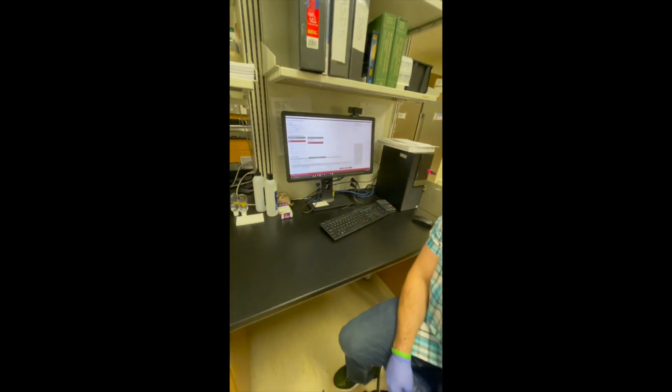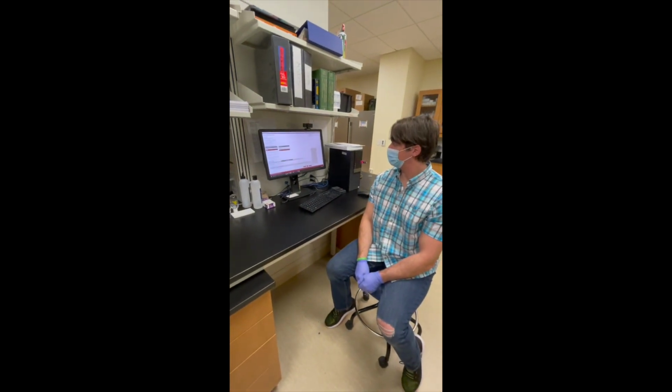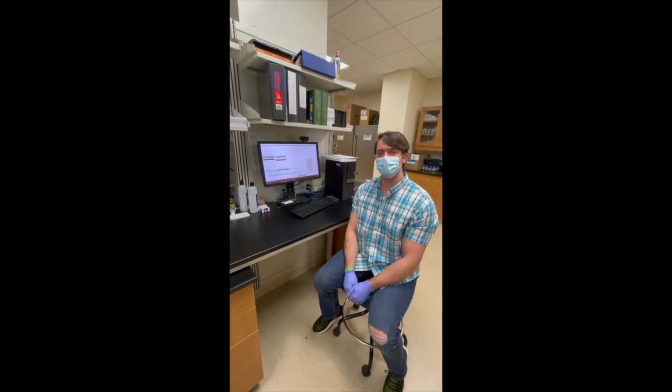And then you would essentially just proceed to do this for all of our samples, and that's how you get our concentrations in the watershed.